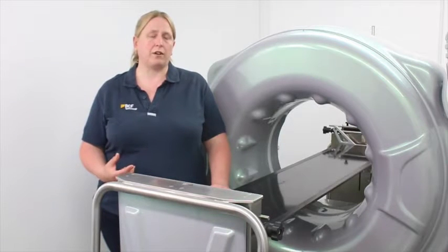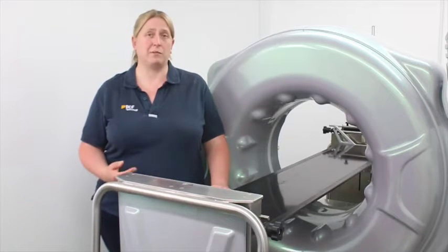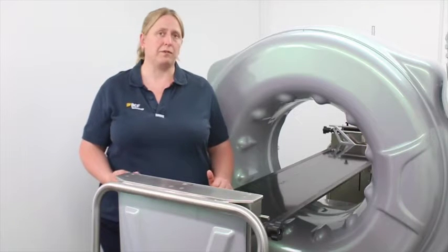The installation of the machine is very quick and simple. Once your room is ready and has been checked by your RPA, it normally only takes us two days from the delivery of the system for it to be fully up and running and able to be used. The scanner will easily fit into a three by four metre room or smaller, depending on the shape of your room.